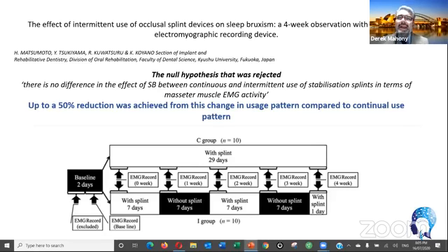And you put that in, you put your lip seal device in, and I shove those nasal cones up my nose because of my deviated septum, right?